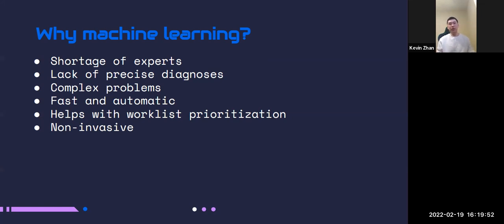For one of the examples that I'll be talking about later, diabetic retinopathy, it's a disorder that's easily treatable, but in some places there's not enough ophthalmologists, right? And this can be quite a big problem because untreated, it could lead to blindness. So being able to have this quick model or algorithm that can diagnose it could prevent this, and that's the rationale behind their paper.